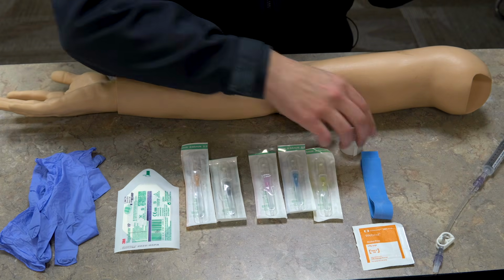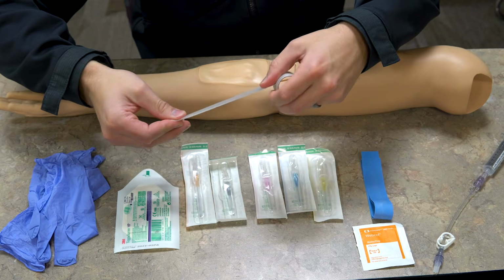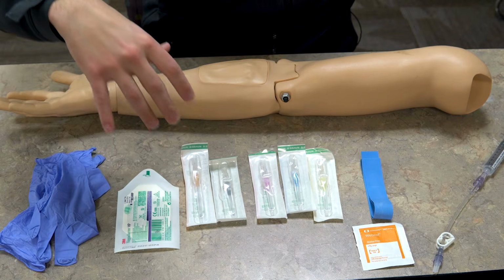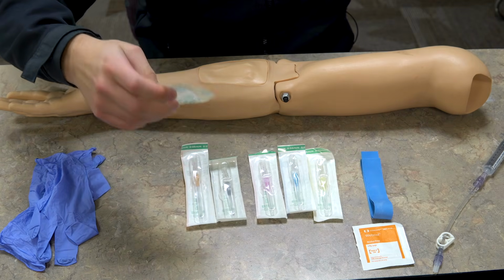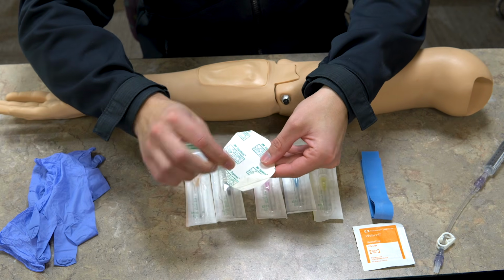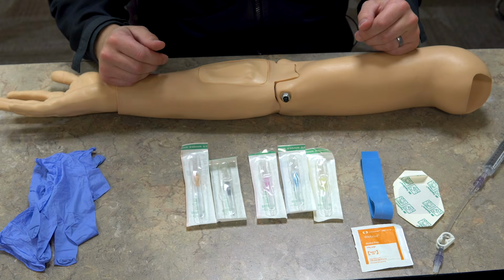All right, next thing we wanna do is cut some tape strips. I'm going to put those on the end of the table. I doubt you can see that. We're just going to cut 2 short tape strips. And now I'm going to take the Tegaderm out of the wrapper. I like folding the end back here because that allows me to pull this off really quickly with one hand. I'm going to set that aside as well.